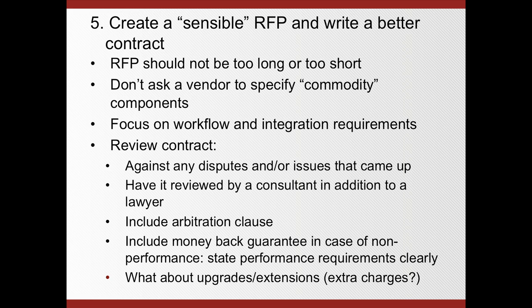Particularly important if you have a vendor that is not necessarily one of the mainstay vendors. If you have, let's say, a relatively small vendor that looks really attractive because potentially they have a lower price point, or they promise a better service or a certain functionality that they can custom build for you, in that case it's even more important to make sure that you're covered by a non-performance clause, because they might not always be able to perform. So state performance requirements very clearly.